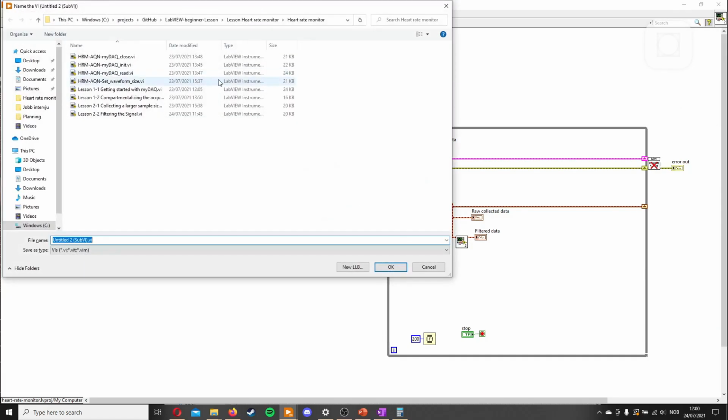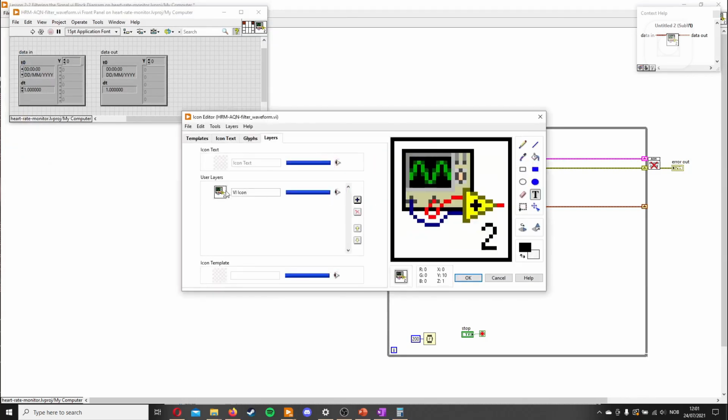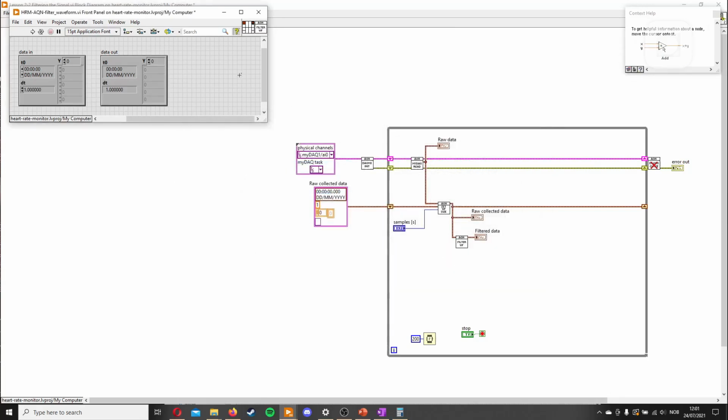Let's save this VI. Let's select here, and we have filter waveform. Let's just copy here, filter waveform. And we'll edit this icon. And this is filter waveform. And now we have our VI.